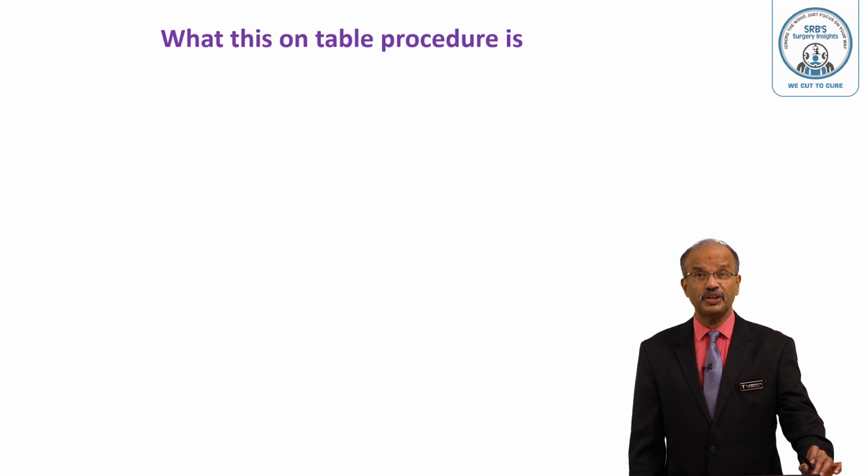Dear students, today we'll have a discussion which is more of an on-table finding rather than an operative procedure, but it has become very popular. A recent advance, I can say, is this on-table procedure. What is this on-table procedure?